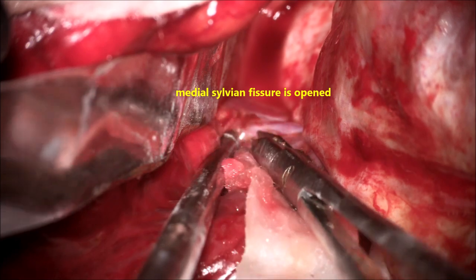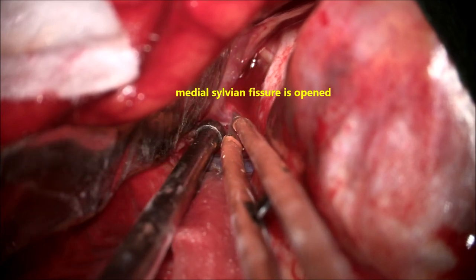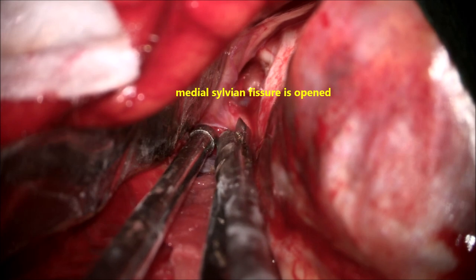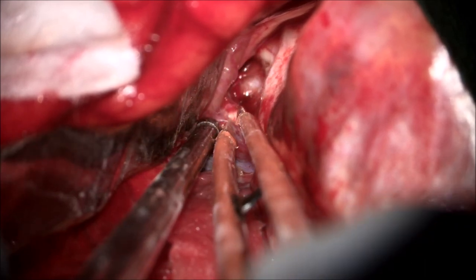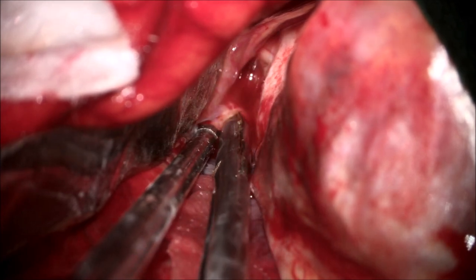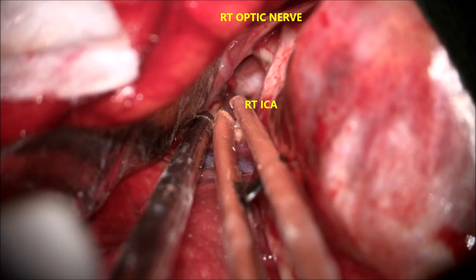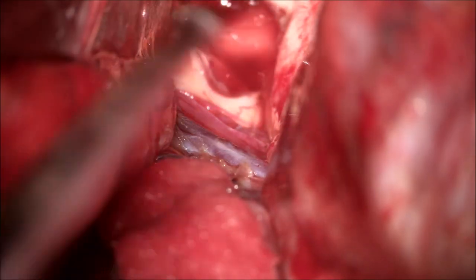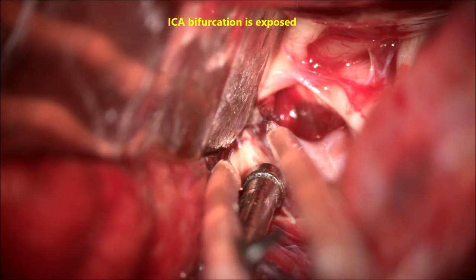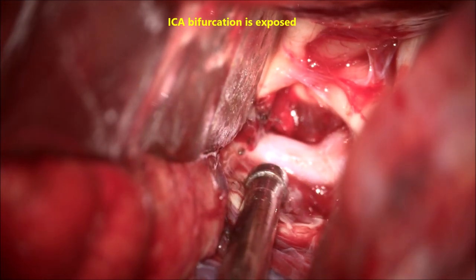Opening the cistern releases CSF, which helps relax the brain. The medial end of the Sylvian fissure is then opened. One must remember that while opening the Sylvian fissure, no vessel — artery or vein — should be injured or damaged. This is critically important to avoid postoperative ischemia to the temporal and frontal lobes and deeper brain structures. The optic nerve and internal carotid artery are now visible, and blood clots in the basal and suprasellar systems are removed, exposing the artery clearly.